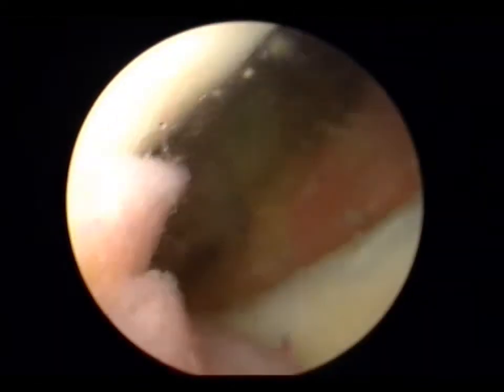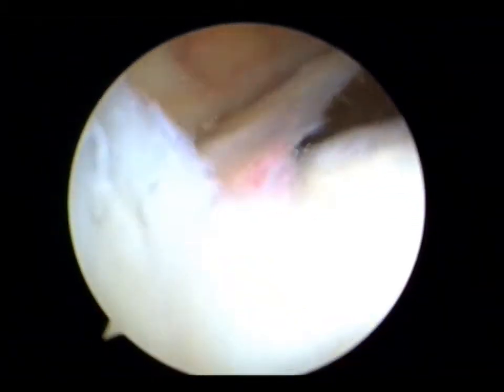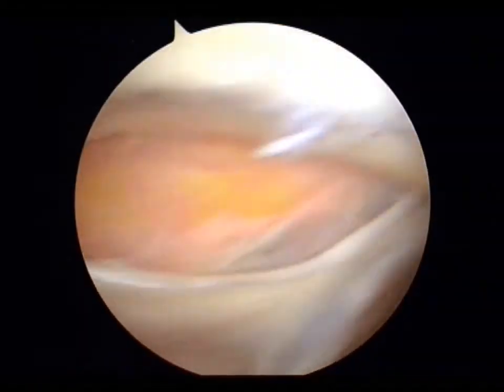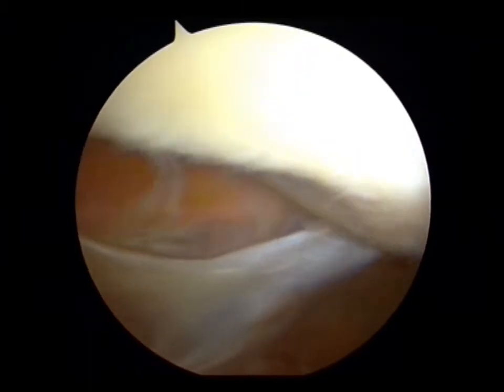So when dealing with the suprapatellar plica — and I tend these days to use not the shaver you see here, but an arthrocare ambient wand — by dealing with the suprapatellar plica, you decrease the load in the patellofemoral joint. By dealing with Hoffa's fat pad and the impingement, you allow the patella to recover.